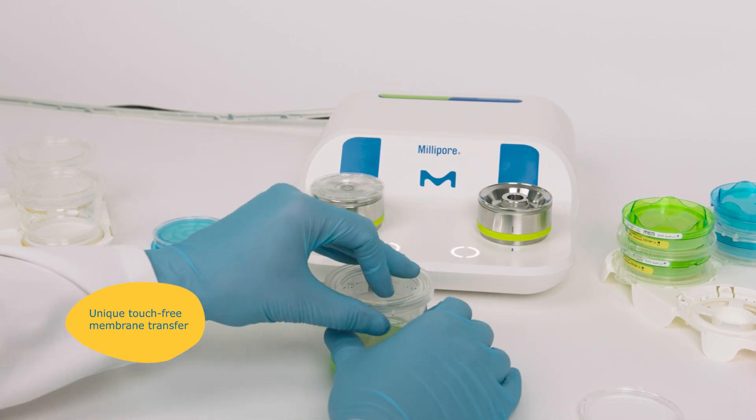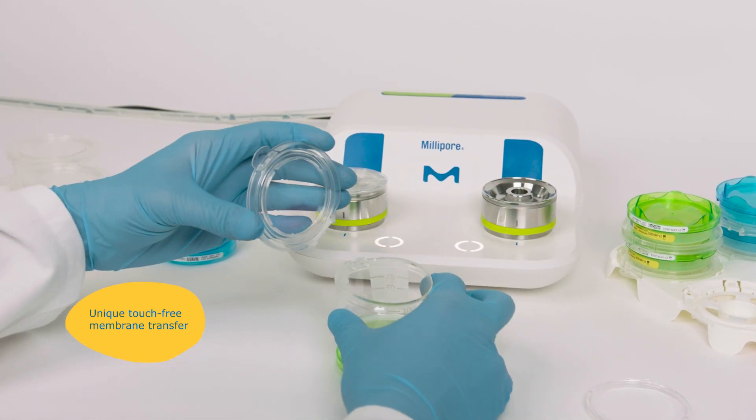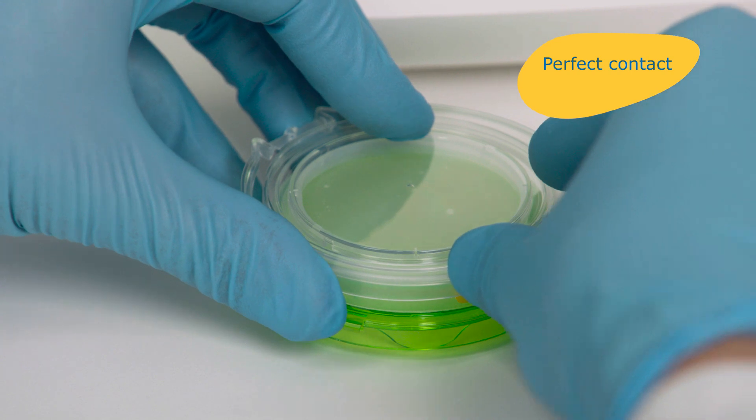This is easy and safe to do, thanks to its unique no-touch Milliflex Protact features.